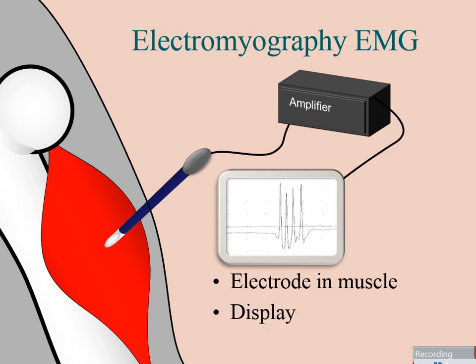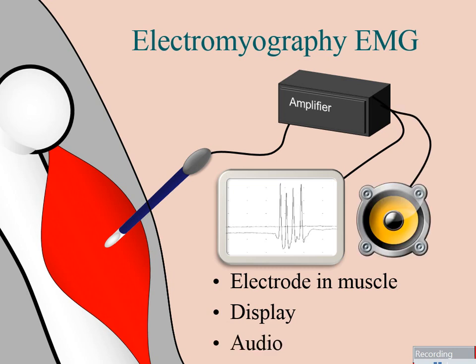And then that electrical impulse is amplified. It's displayed on a screen. Used to be an oscilloscope, now it's all computer-based. And there's audio that we listen to.